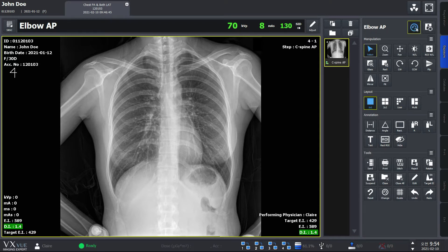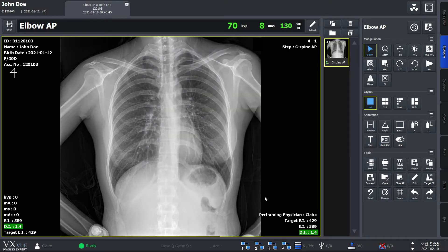To correct this, click on the button here. You'll see the Step List window — find the correct body part, projection, and patient size information. When you're done, click OK. You'll see that the step information has changed on the thumbnail. This can also be a useful function when you have an urgent patient coming in. In that case, just go for extra exposure immediately and change the step and patient information later with the Change Step function.